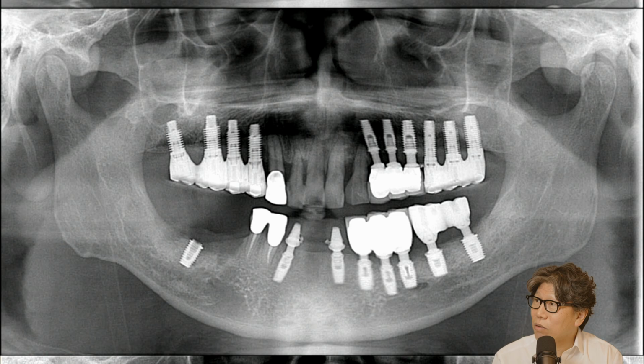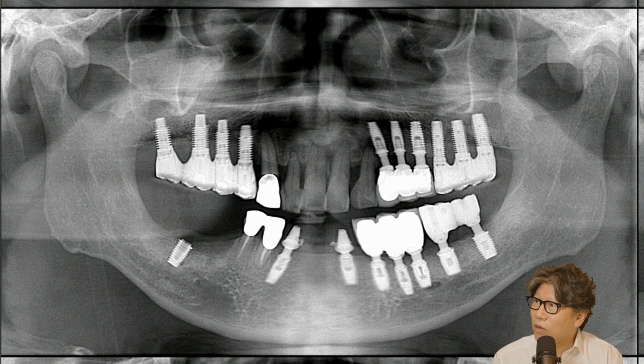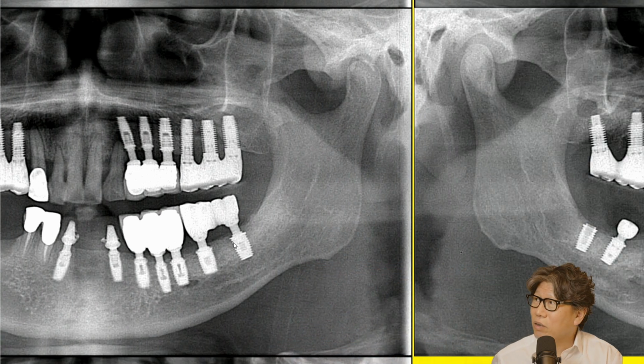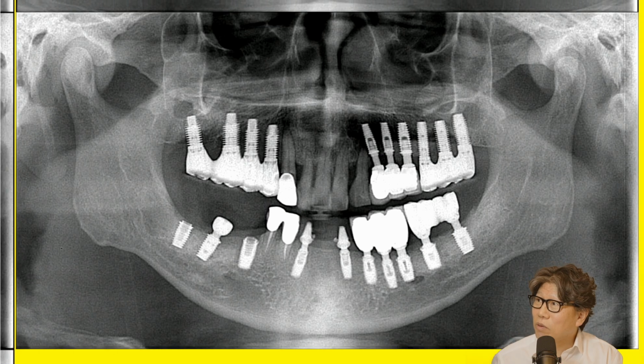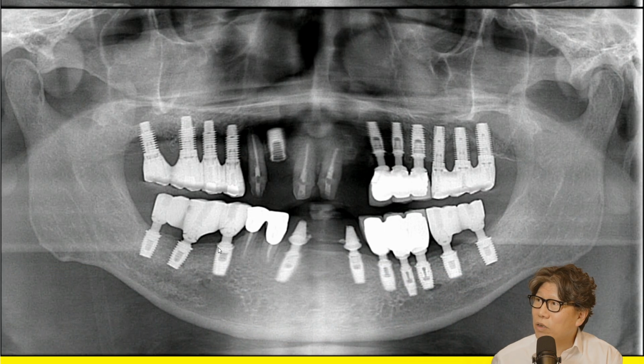Same thing, you wait, you put it in, you wait, it fills up again. You look at it, and it's full. Right? And then I plant another fixture, and then I wait, and then it fills up again. So it's a cycle.